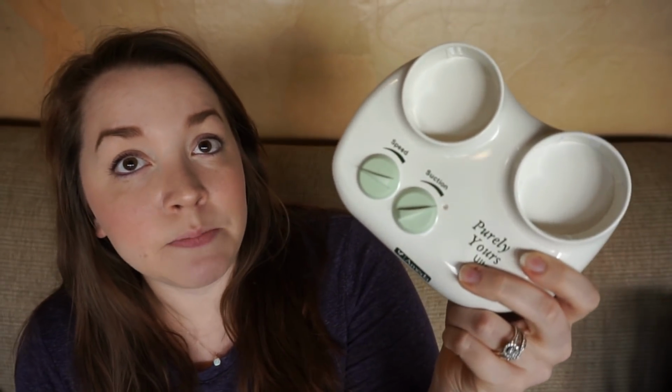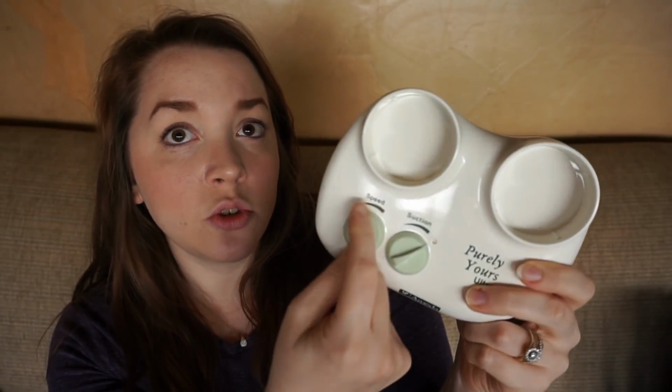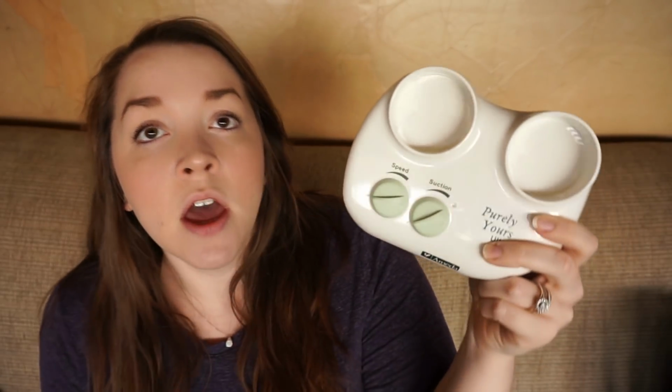Number 2 is function and ease of use. Now this is pretty poor because, as you can see, you have a suction and speed dial right here. So you just twist these in different directions to go up or down, obviously in strength, and it's all manually controlled. So what that means is that your suction, your speed is entirely up to you. You're deciding what it's going to be, which can sound like a good thing, and it is because you can entirely personalize it to a point.